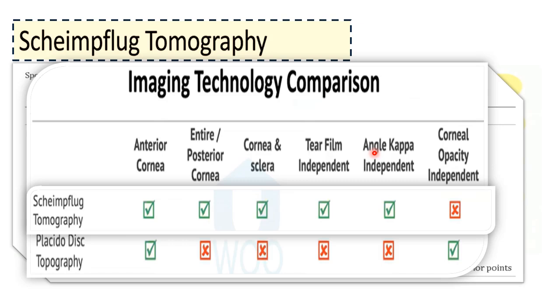So the Pentacam is a huge multimodal system that gives detailed information about the cornea, and it has become the gold standard in any refractive surgery. It has also been, for a long time, the gold standard in glaucoma management, as it gives detailed information about the anterior segment and the relation between the iris and the cornea.